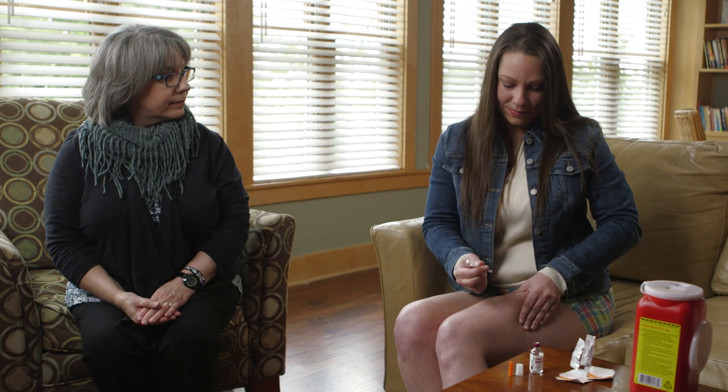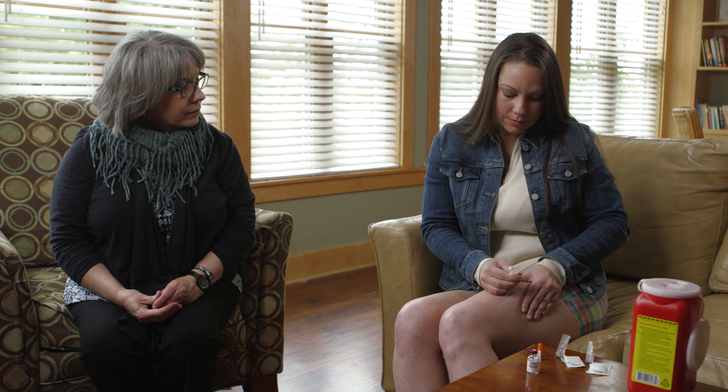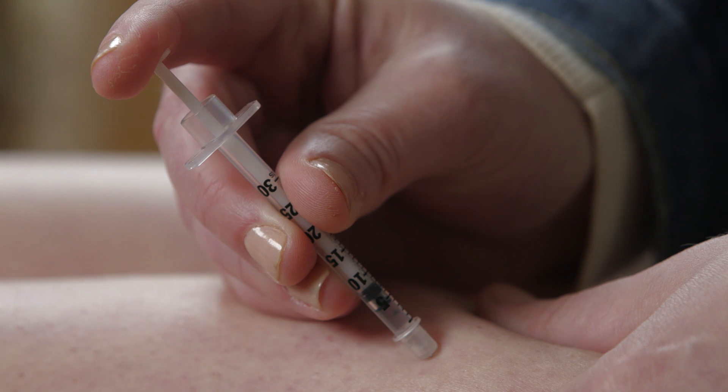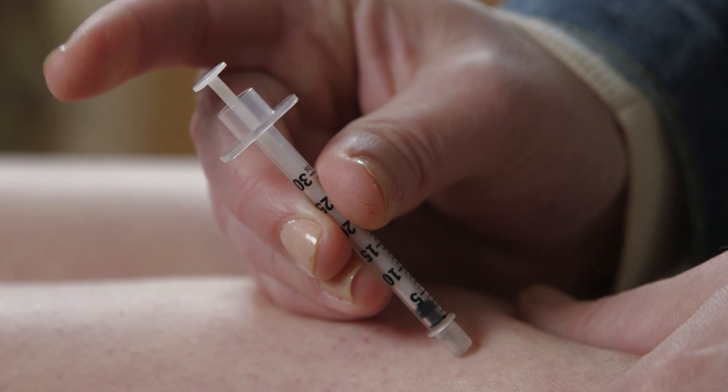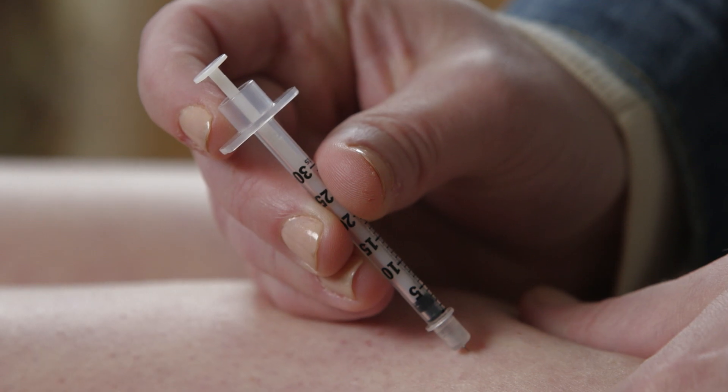Gently grab the skin where you want to give the injection. Hold the syringe like a pencil in your writing hand, insert the needle at a 45 to 90 degree angle, and press the plunger until the syringe is completely empty. Slowly count to three. Let go of the pinched skin and remove the needle, pulling it out at the same angle that it went in.